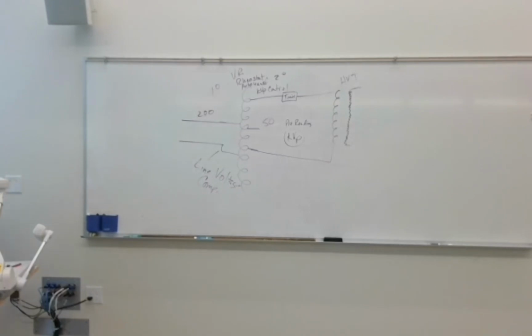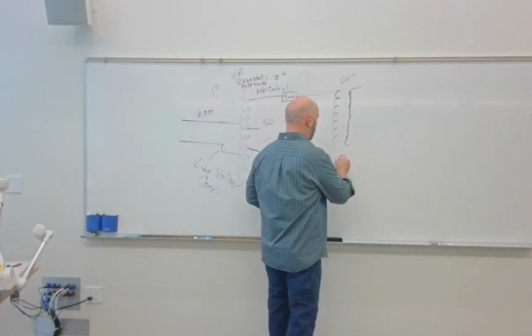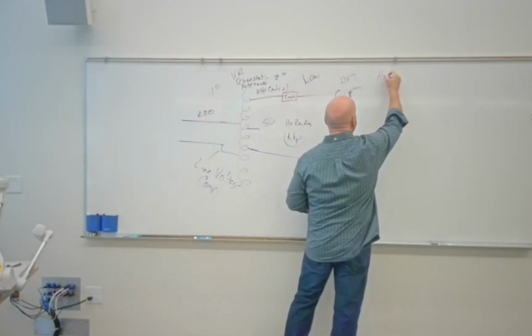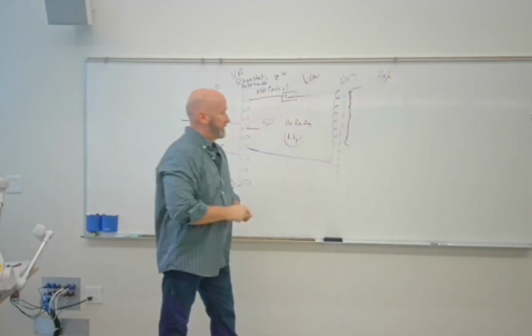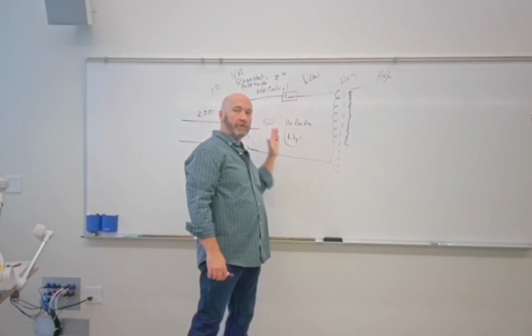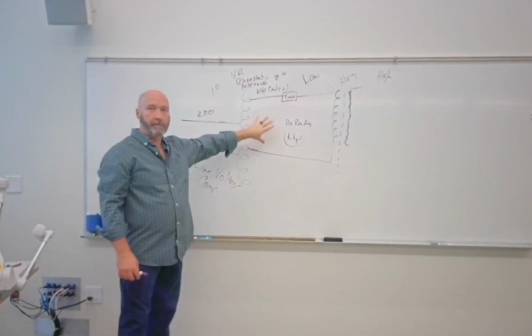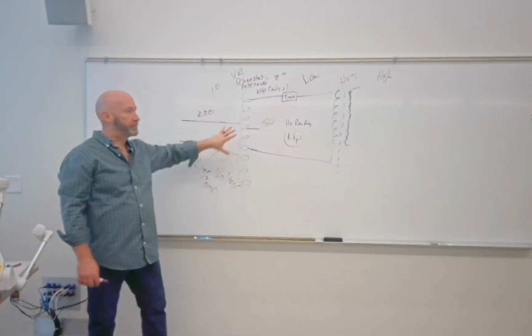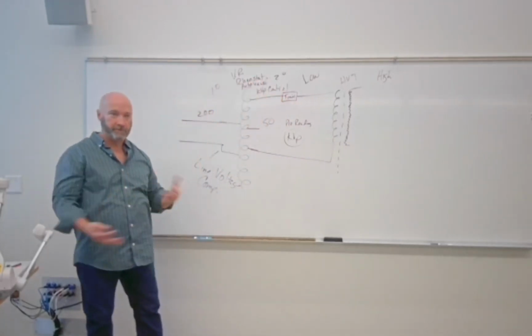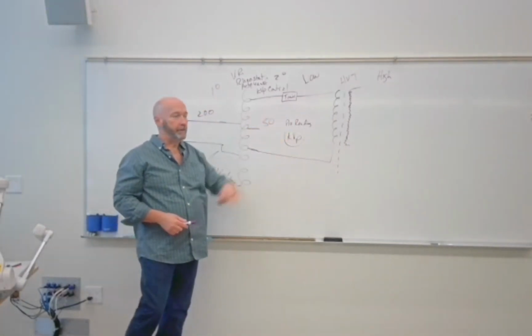What I'm going to do is split the circuit right here on the test. This is going to be the low voltage, and this is going to be the high voltage portion of the circuit. I'm going to split it right down the middle. Everything on this side is going to be low voltage, everything on that side is going to be high voltage. Everything that we can control, we're going to control from here, because it's low voltage. You go pushing on those buttons and it's powered with 100,000 volts, it's going to hurt, right? So we're going to control everything we can over here.